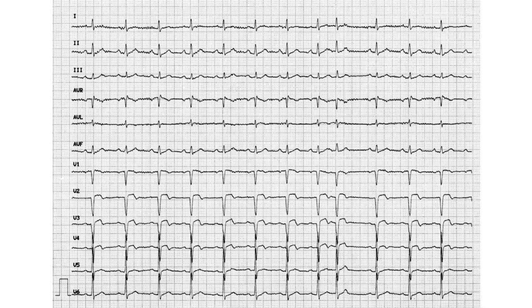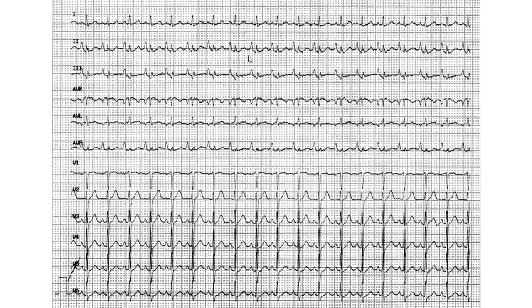Not that there always is a pathology, but it's safer that way, so that you don't miss a patient who really does have one. Within logical bounds, obviously. So you don't say that this patient has fibrillation when he clearly does not, because the patient is just twitching.